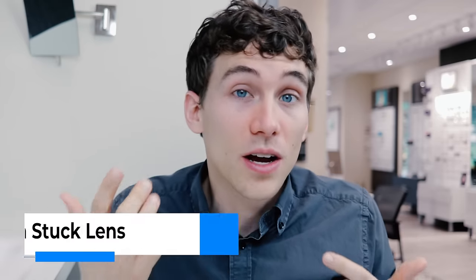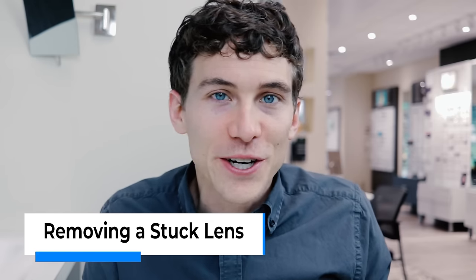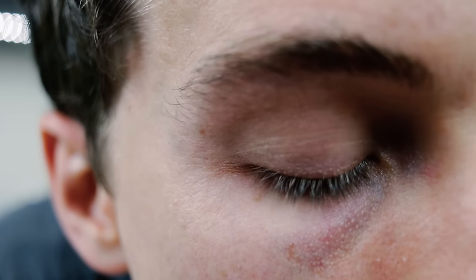Every once in a while, even a contact lens veteran will have this issue where the contact lens could slide and get stuck underneath your upper eyelid, and no, it does not feel very good. Usually when this happens, the best way to handle it is honestly just to look straight down and keep blinking your eye. Sometimes that process will cause the lid to grab the lens and slide it down back toward the front of your eye, right on your cornea where it needs to be.